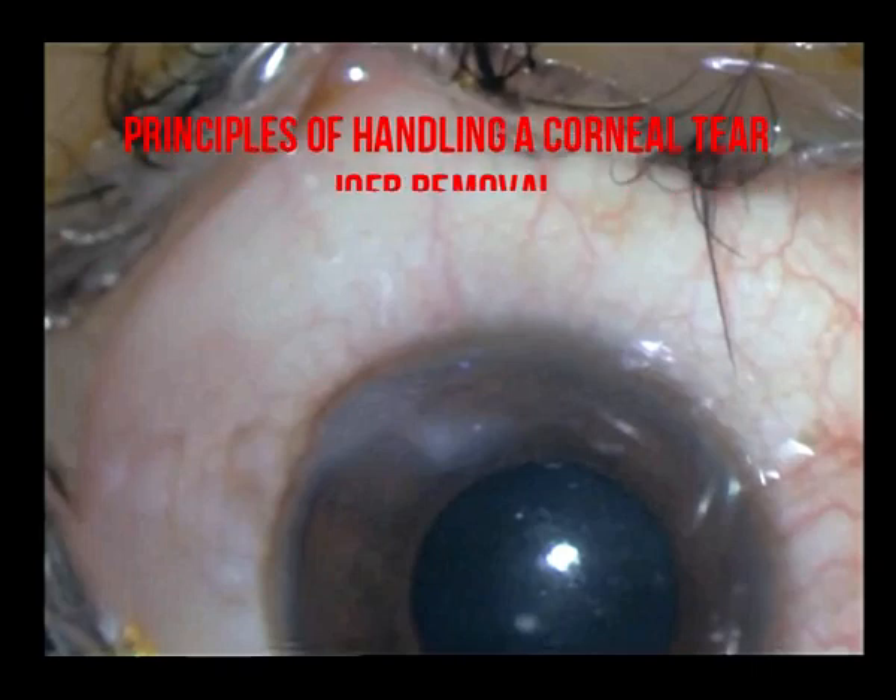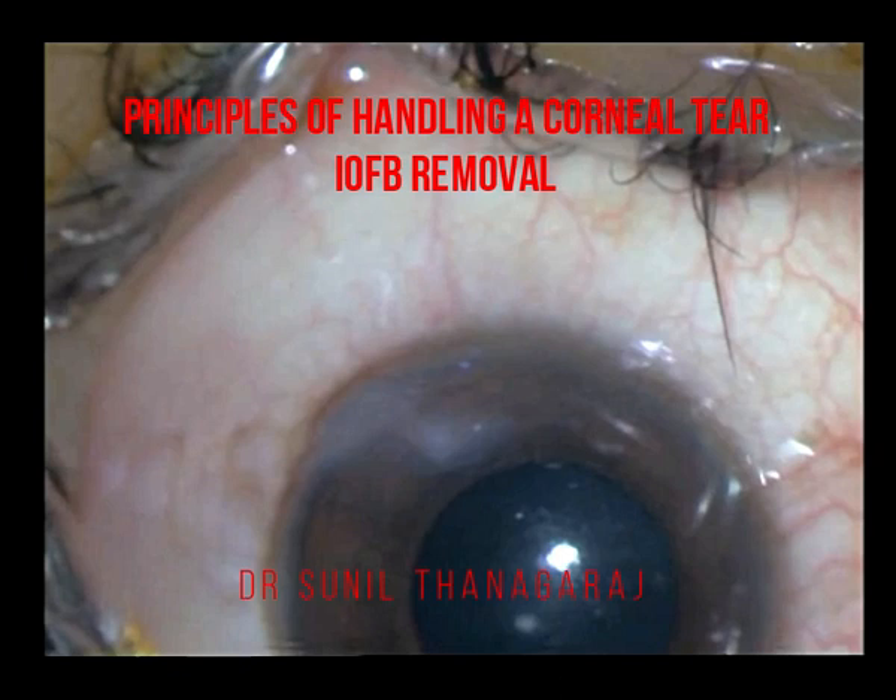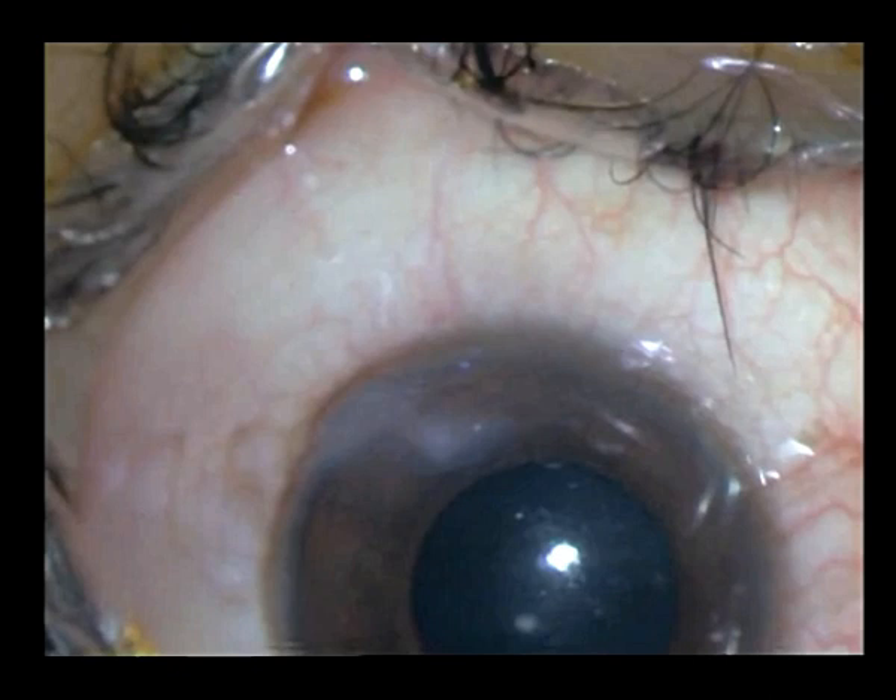This is a young male who suffered a penetrating injury and reported to us a few days later. You can see that the wound edges are slightly edematous and in a z-shaped pattern. If you look carefully in the periphery of the AC, there is a hair follicle which has got entrapped within the anterior chamber.